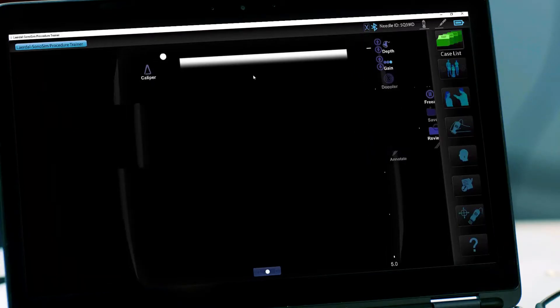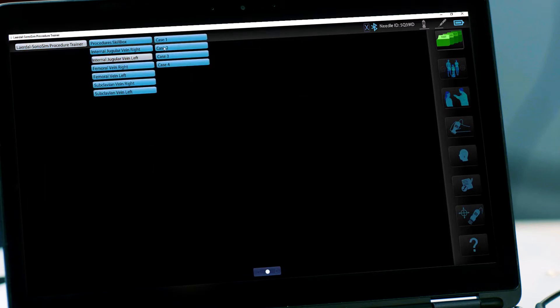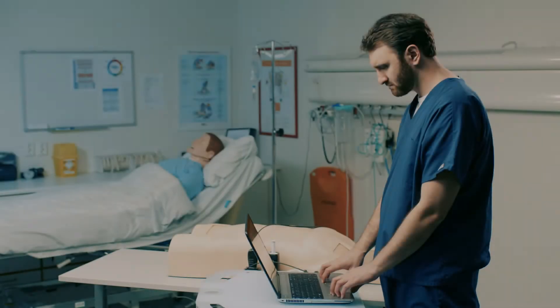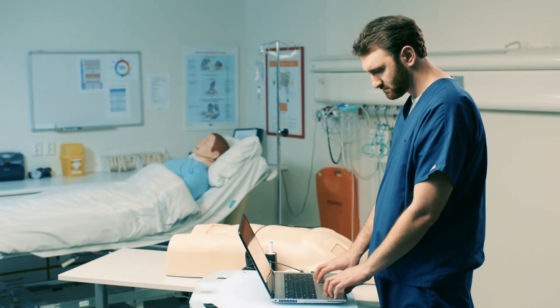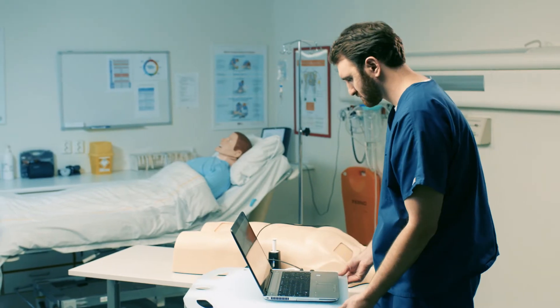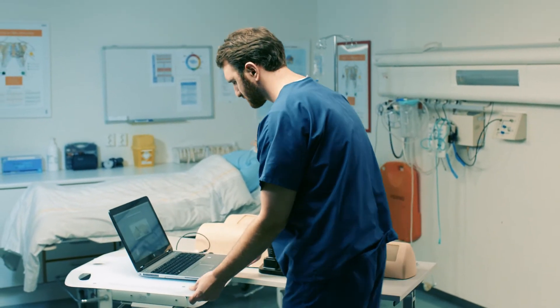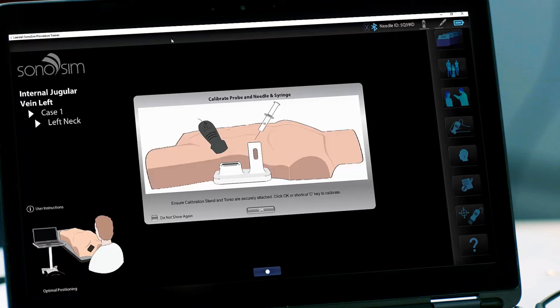Use the Case button to navigate to your desired case. Review the optimal positioning diagram in the lower left corner of the screen. Position yourself, the torso, and the computer to match. You will be asked to calibrate before starting each case.